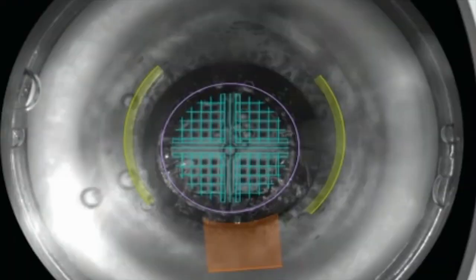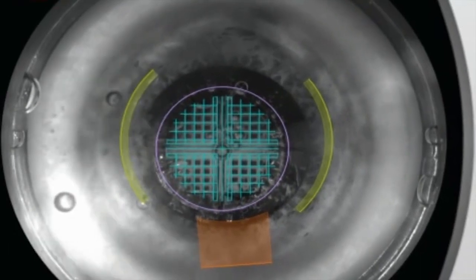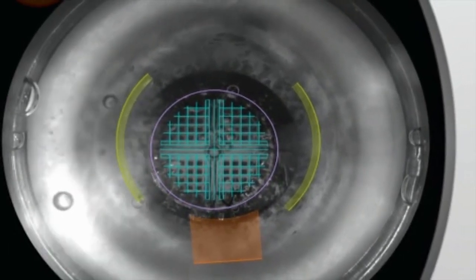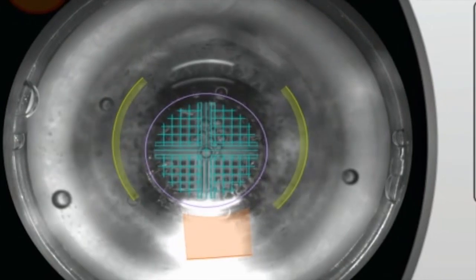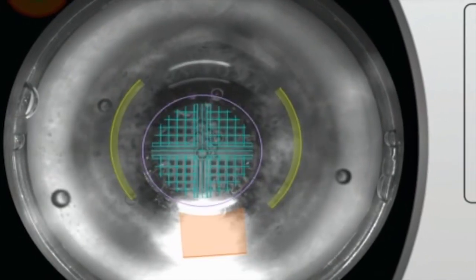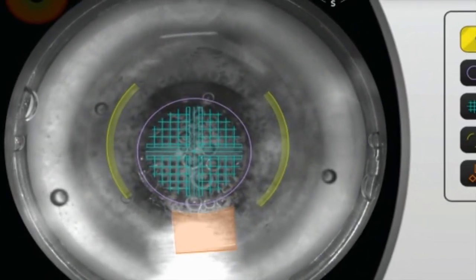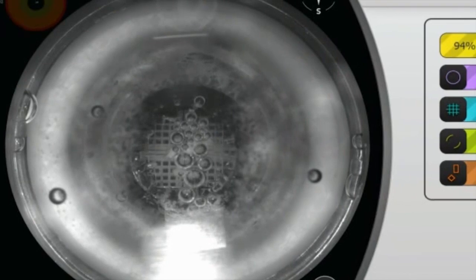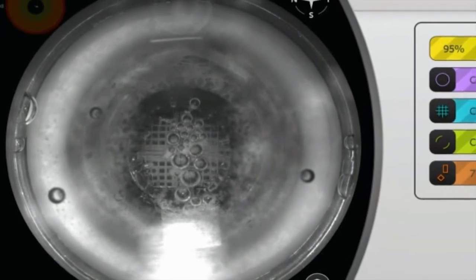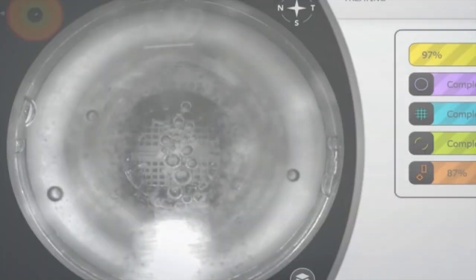We obsessed over every specification of the laser. The pulse width, the pulse energy, the pulse duration, the frequency. And we had to work very hard to get all of those characteristics exactly right. It took years of development. But when we finally got it right, we have a system that does capsulotomies and fragmentation of the lens perfectly.